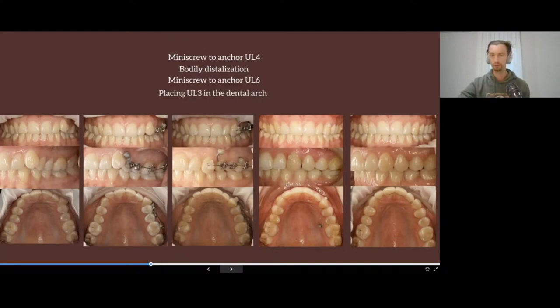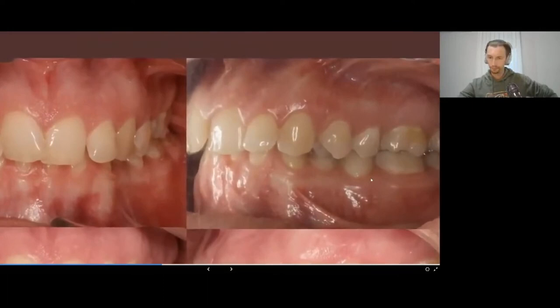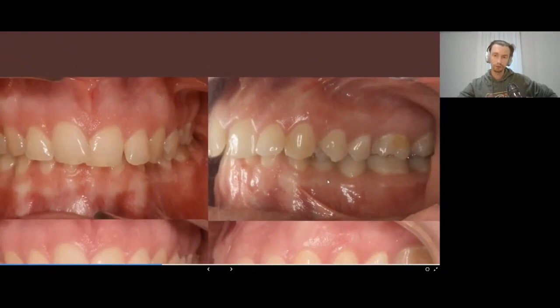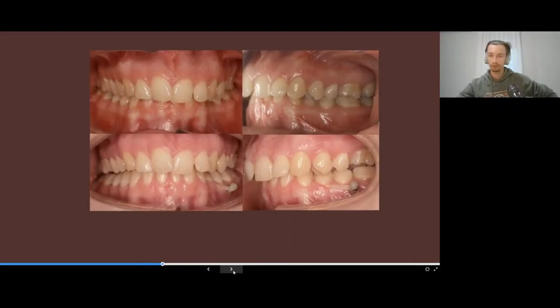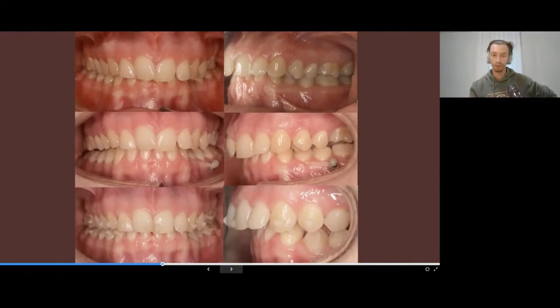Another non-standard case: deep bite. You also see a scissor bite on premolars on the left side. Teeth three and four are lingually inclined. For decreasing the overbite, I place a button on the lingual part of the tooth, a mini screw, and elastics. What we get is normal overbite and normal contacts between posterior teeth.